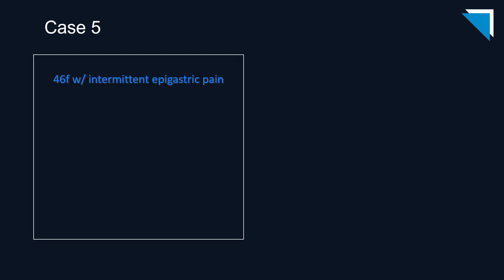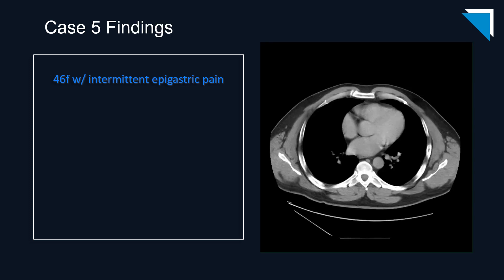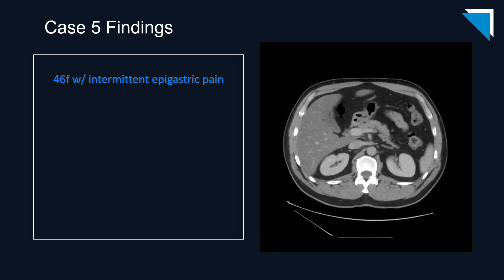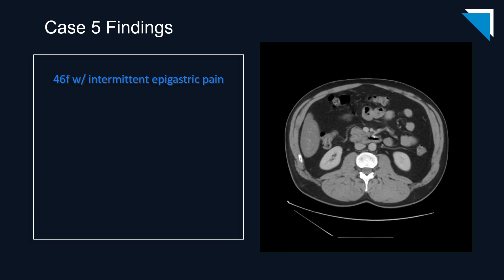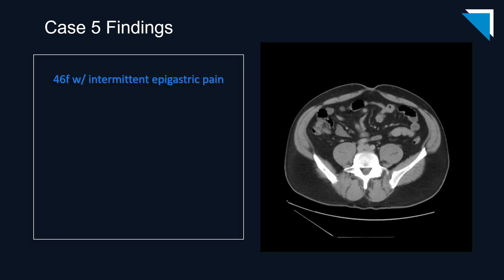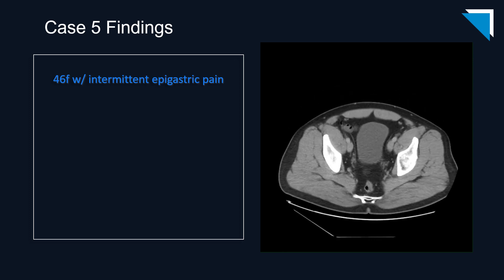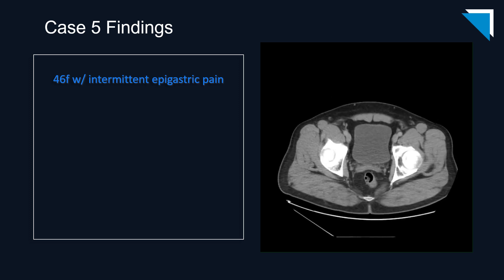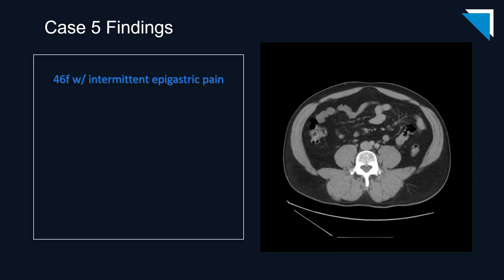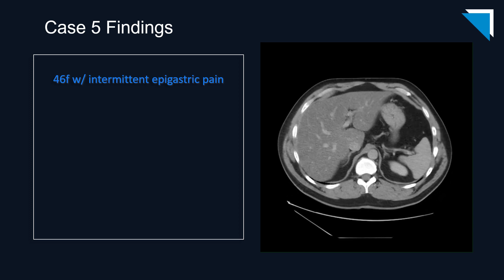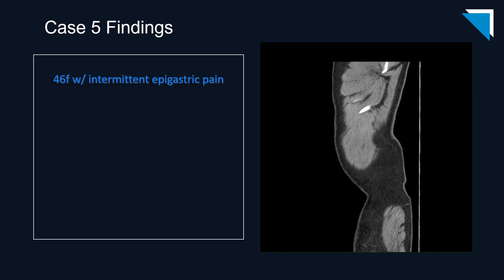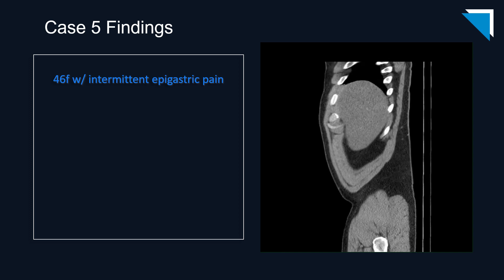Our last patient for this session is a 46-year-old woman with intermittent epigastric pain. These are axial images from a contrast-enhanced CT scan of the abdomen and pelvis, as well as the sagittal images from the same patient.